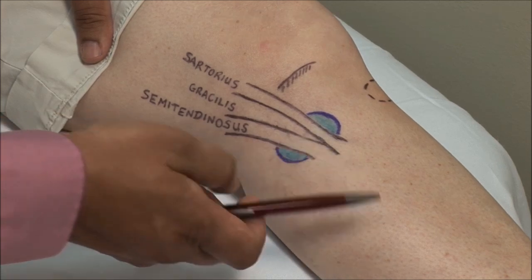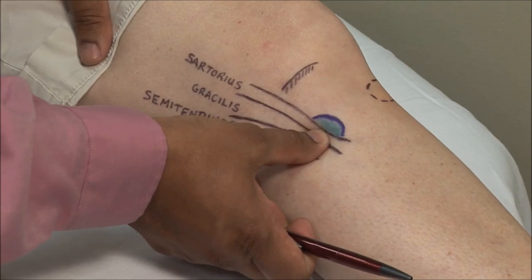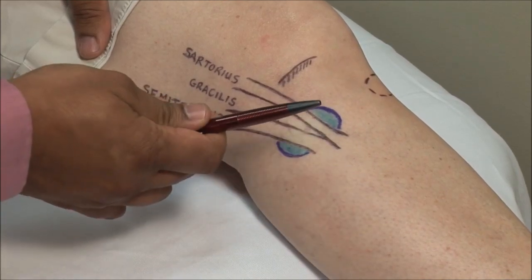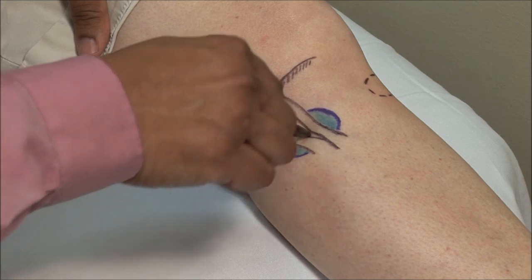Ask the patient for the point of maximal tenderness, and then, using a retractable pen, mark the point for injection.